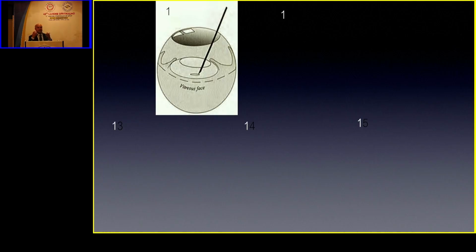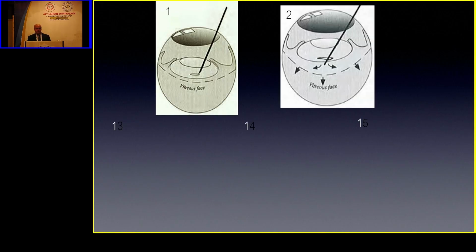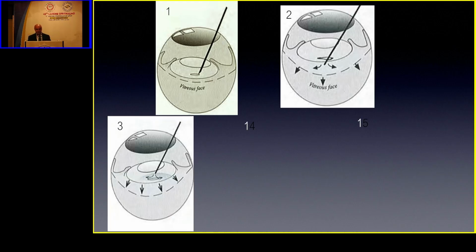So the idea here is that we want to make a continuous tear in the posterior capsule without interrupting the anterior vitreous face. We know there is a space between the posterior capsule and the anterior vitreous face. So you want to do it without the need for anterior vitrectomy or disrupting the anterior vitreous. And this can be done by initiating a tear in the posterior capsule, then injecting viscoelastic, whatever type of viscoelastic, to push away the anterior vitreous face.